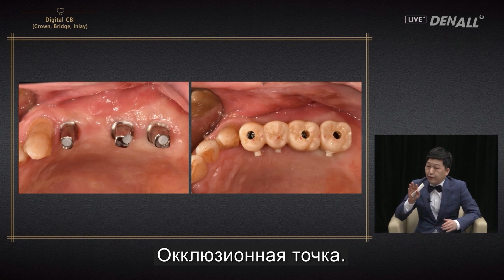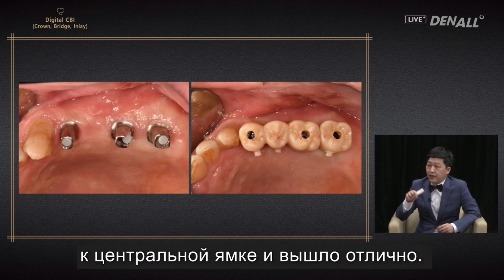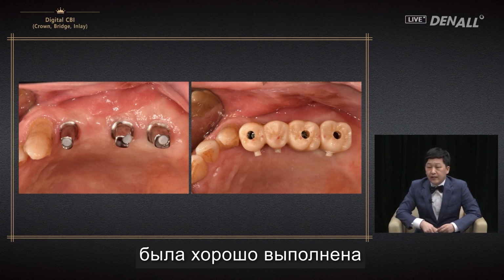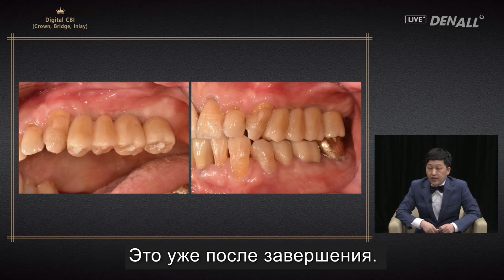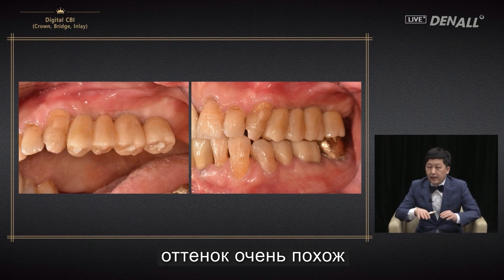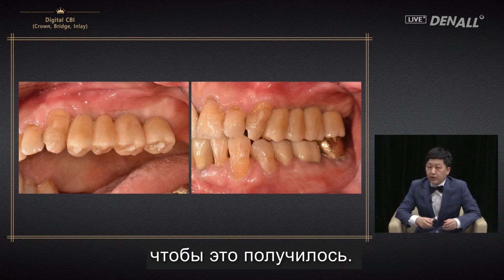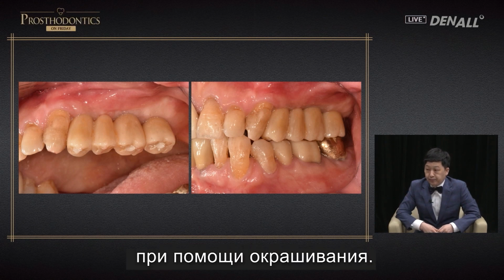The occlusal point, I tried to make it come to central fossa, and it is nicely done. In this case, occlusion was very well done. Occlusal adjustment was barely done, and setting was done. This is after completion. If you look at the profile, the shade is very similar to adjacent teeth, and I put in a lot of effort to do this, and this was made possible with staining.